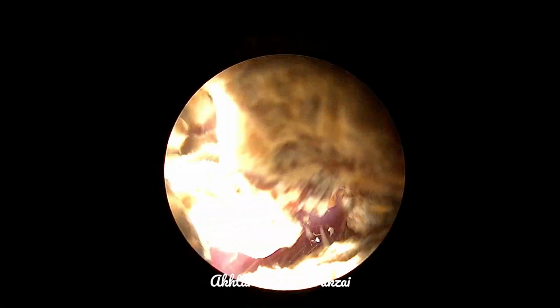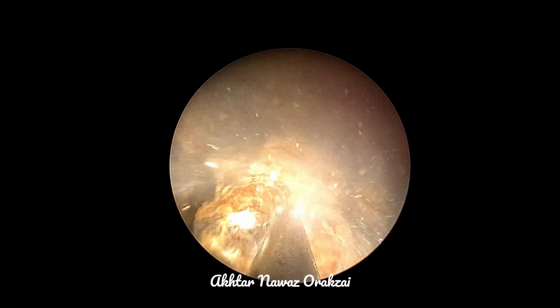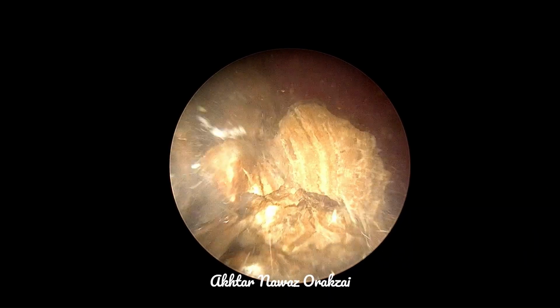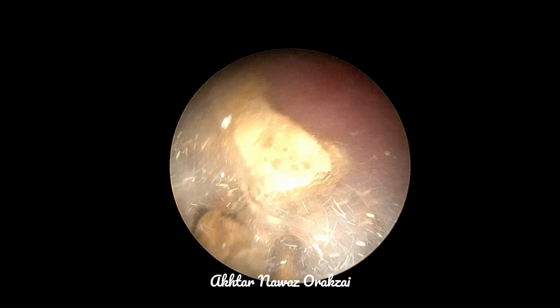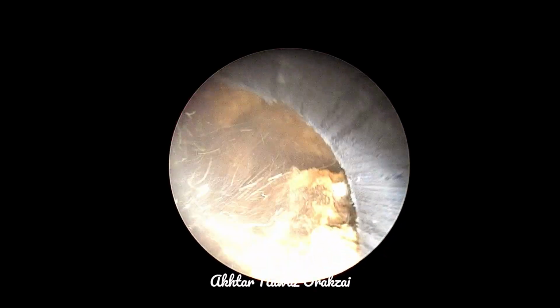So we agreed upon doing the procedure in two stages. In the first stage, we'll perform a percutaneous cystolithotripsy and clear his urinary bladder of the stone. And then after 3 to 4 weeks, we'll perform his transurethral resection of the prostate. So this is the first stage now. It can be seen that the stone is really hard.